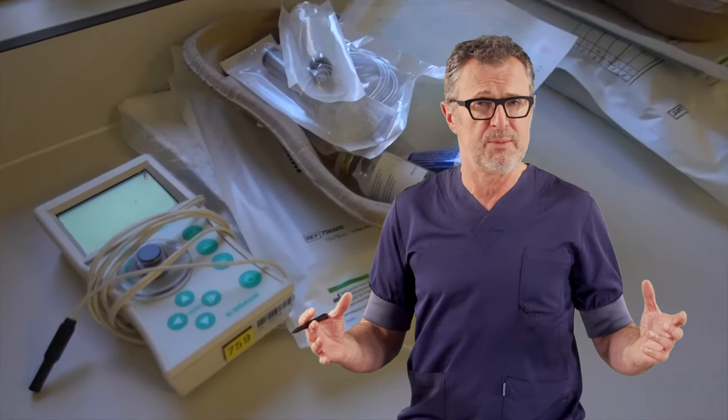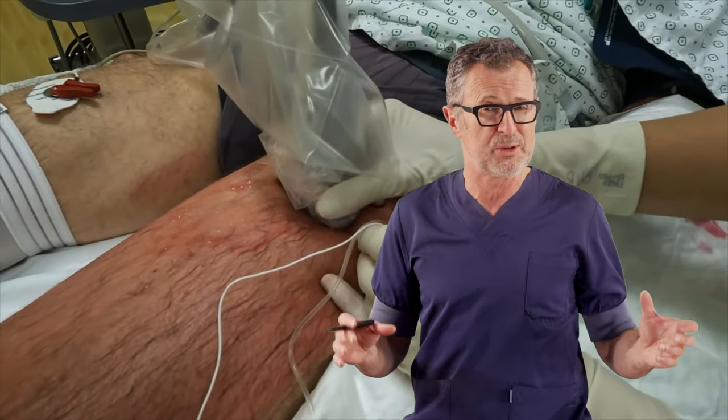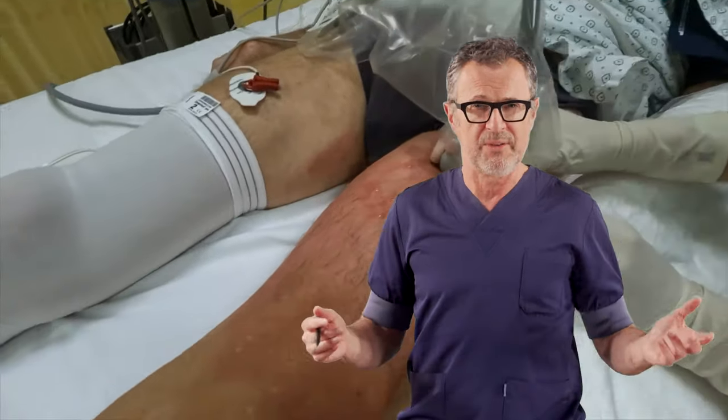If you use a nerve stimulator like we do, you may be able to observe a distal motor response that would alert you to the fact that the needle is just about to penetrate the fascia when it is almost in contact with the nerve that you would like to block. And therefore, it provides you another level of safety.